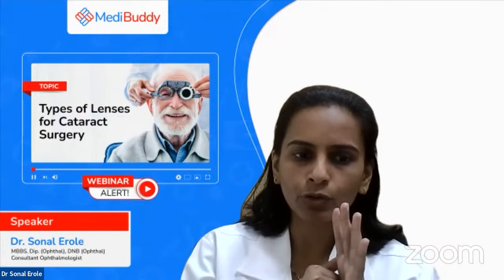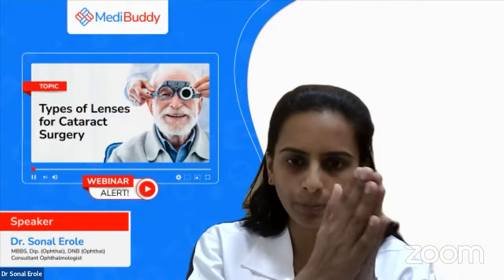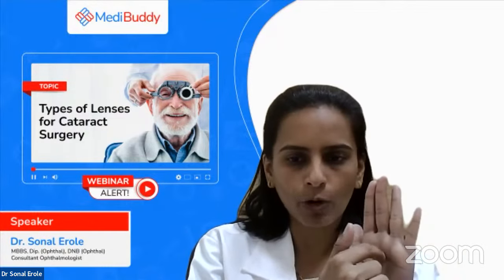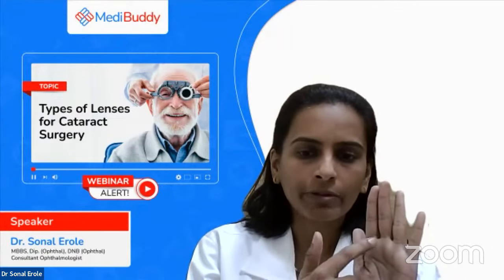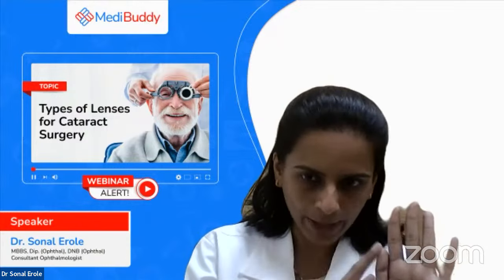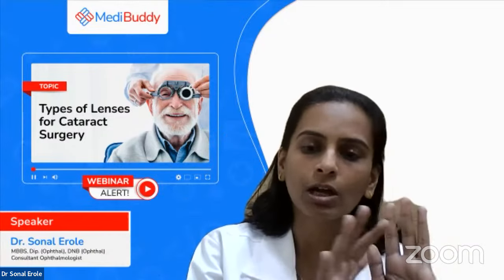Just like the monofocal lens, it will have a single plane only, but it will have different zones on it, carrying the powers for distant, intermediate and near vision, placed according to the pupil size. With these IOLs, the patient can see for the distance, for the near, and even for the intermediate without glasses.